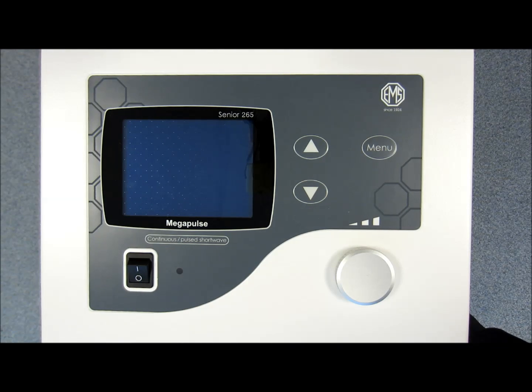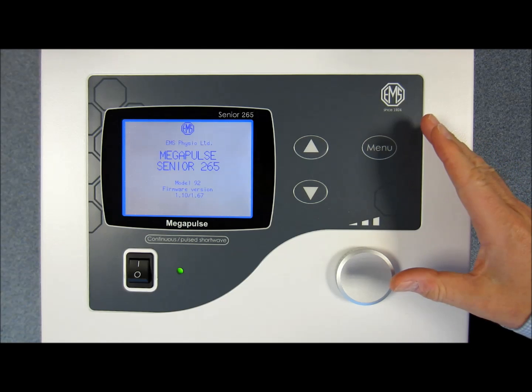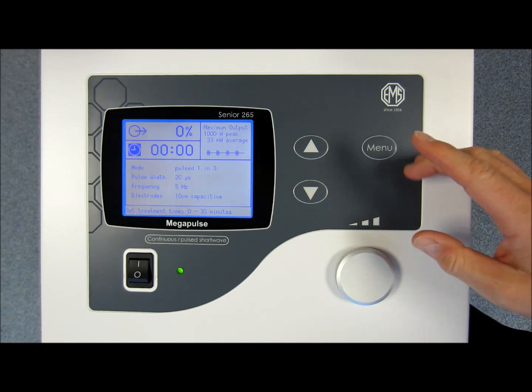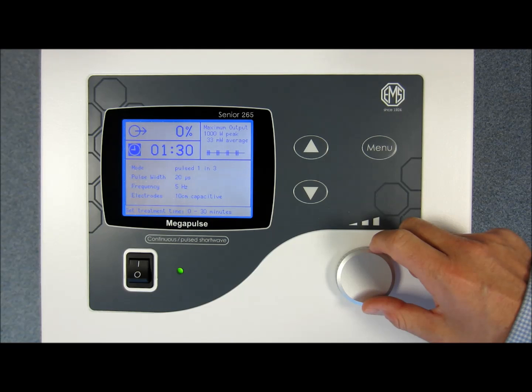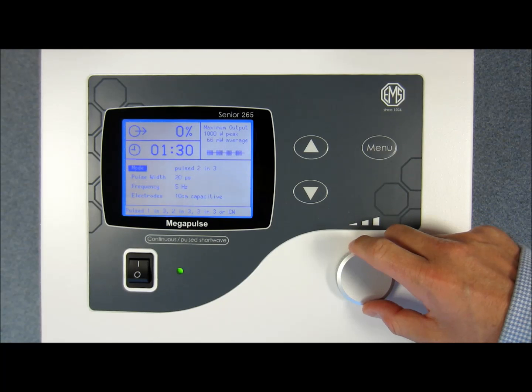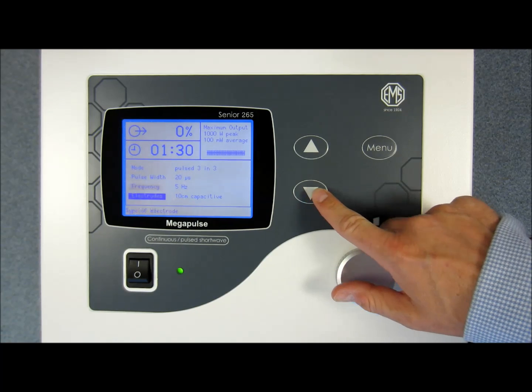One of the benefits of the Megapulse Senior, and indeed any product from EMS Physio, is that it is so simple to use. All the settings are controlled via this user interface panel and allow you to set up the machine to your desired requirements. Using the up and down arrow keys and the selector knob, you can quickly and easily set the time, the pulse mode or continuous output, the pulse width, the frequency and the choice of electrode.